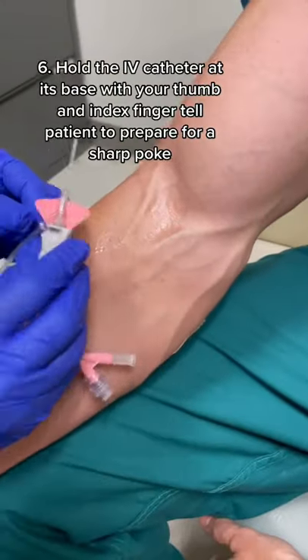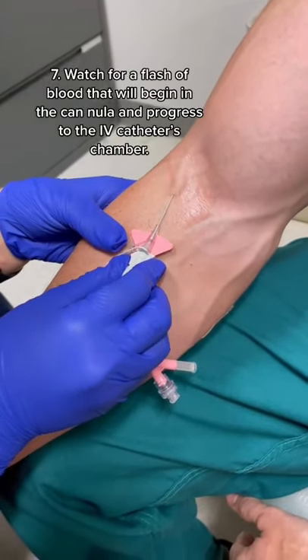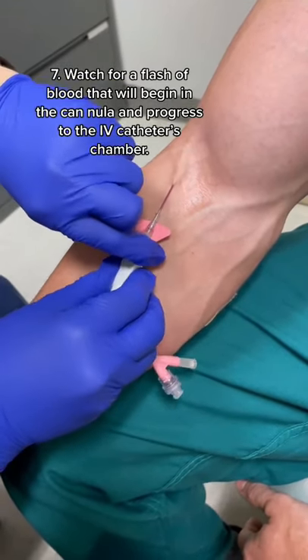Then, get the IV catheter and hold it with your thumb and index finger at the base, and tell the patient to prepare for a poke. Next, watch for the flash of blood that will begin in the cannula and then progress into the IV catheter's chamber.